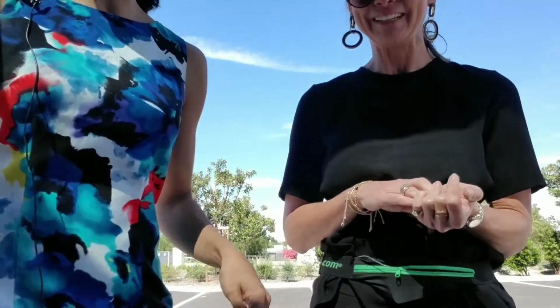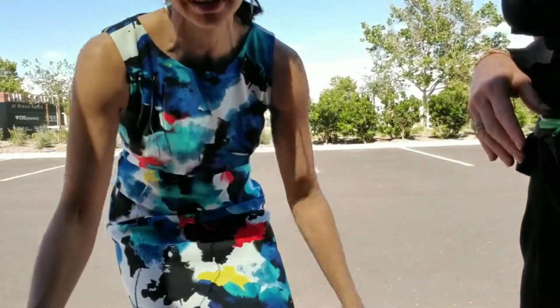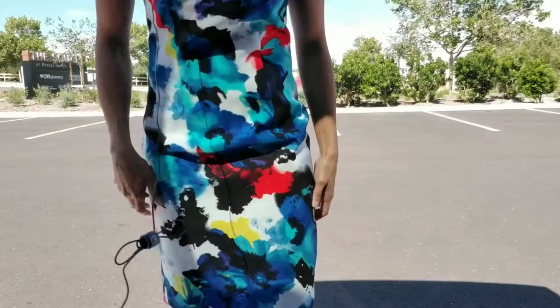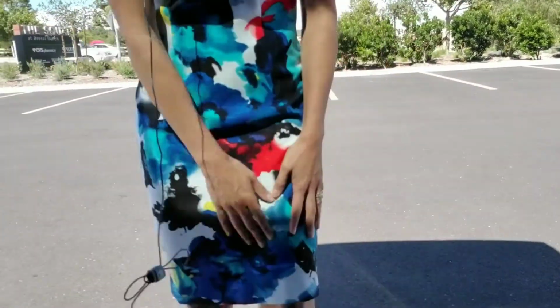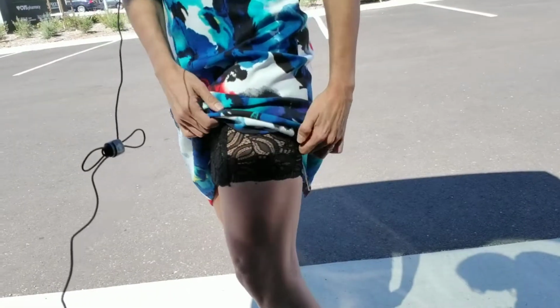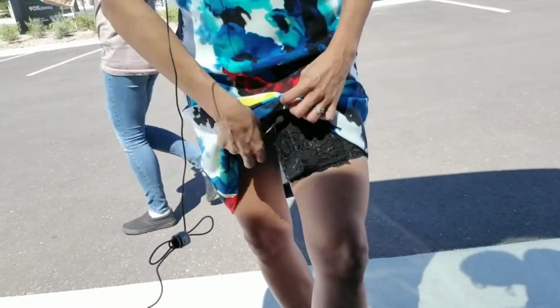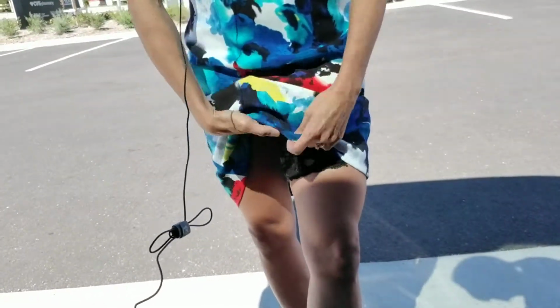All right, now I'm going to show you my little R-rated area where I'm keeping my pump. And another disclaimer, I do not have diabetes, but I do like to wear a pump every now and then just to show people how to wear it. For those of you who like to wear dresses, probably most of you are women, I actually have a garter belt that has my insulin pump right in it. I am attached to the pump, and my tubing is just tucked underneath.